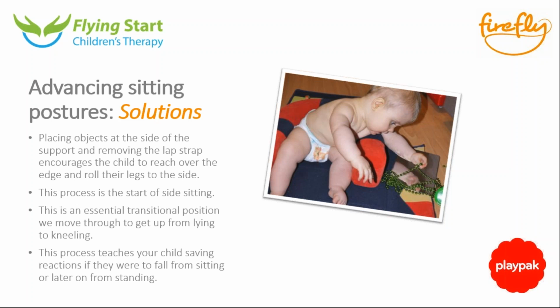So we've got them over the side so that he is reaching over, and you can see that his right leg, so the one on the left of the picture, is starting to roll over to the middle. If he was sat by himself, his legs would always go into that looped sitting position, but his right leg there is starting to roll over because his trunk, his body is taking it that way because he's leaning over.